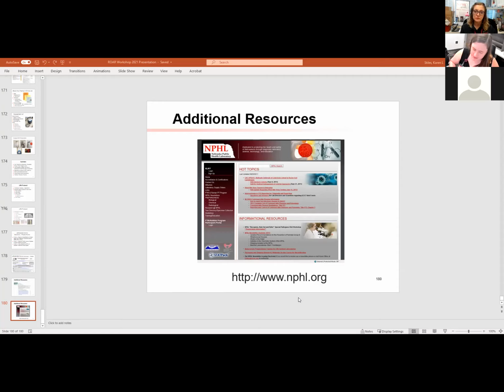I'm sorry, on the shipper's declaration, do we need to put suspected category A infectious substance or actually spell out the organism name? So to be honest with you, a lot of times what you'll do on the challenge set or the LPX, I think you guys might be going to LPX, but I think you'll still get my challenge set too. What I would do is you're given usually some answers and you just have to pick the best answer. So I would say suspicious, but then they'll ask you, what is it suspicious for?